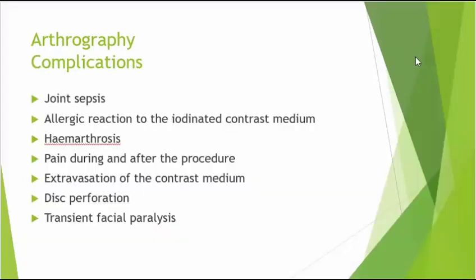Since it's an invasive procedure, it has certain complications like joint sepsis, allergic reaction to the iodinated contrast medium, hemarthrosis, pain during and after the procedure, extravasation of the contrast medium, disc perforation, transient facial paralysis due to trauma to the facial nerve.